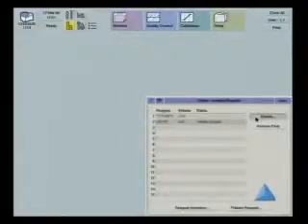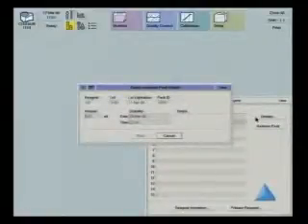If there are multiple status messages for an ancillary reagent, 3 periods will be after the status message displayed. To display all the status messages for that reagent, select the reagent and then Details. The Details window then opens.